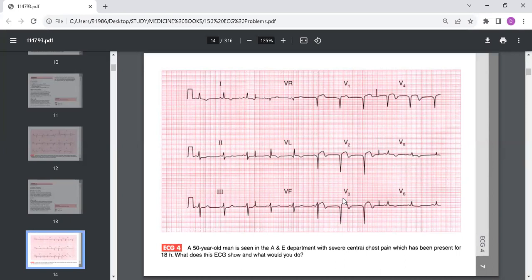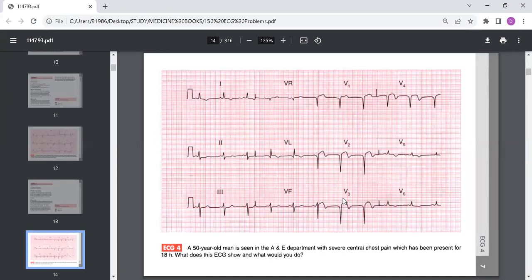This is a classical ST segment elevation MI. We divide ACS into those without ST elevation and with ST segment elevation. With ST segment prominence raised, this becomes ST elevation MI. Non-ST elevation MI if it's not elevated. The majority develop a rise in troponin but this may be prevented by early intervention.